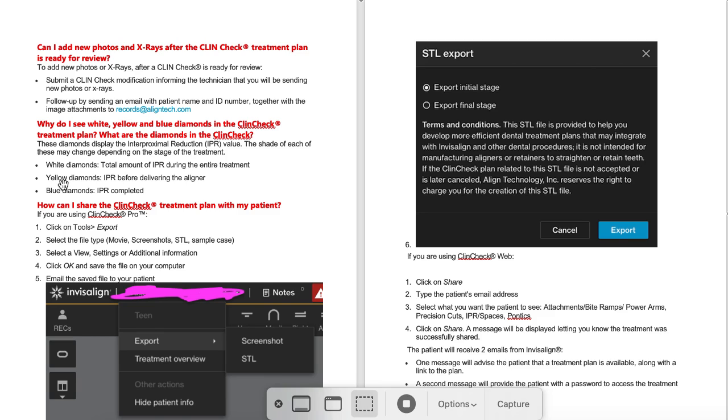As you drag the orange slider at the bottom of your ClinCheck, the diamonds will turn yellow, which shows you when you need to do the IPR by. It's like a library book — you need to get it done before that date, so you can do the IPR any time before it's due. Once it turns blue, the IPR is completed. On a revision, it's going to show you: hey, you've already done 0.4 millimeters plus we're adding 0.2 millimeters. Don't go over that 0.5. Check your charting — did I actually do it? And if they're asking for too much per interproximal space, you can ask them to restage it more posterior or on other teeth if possible.